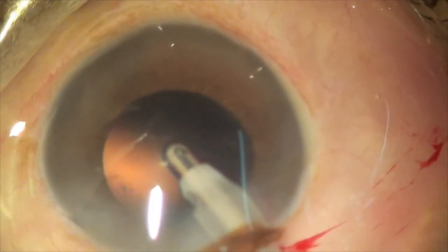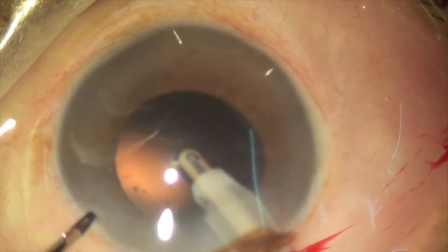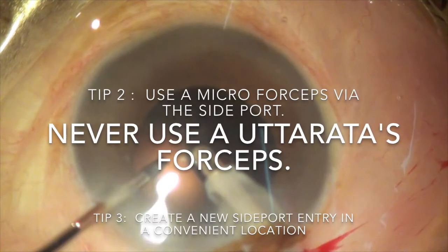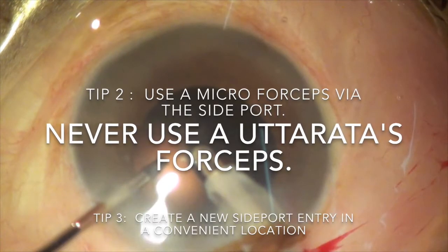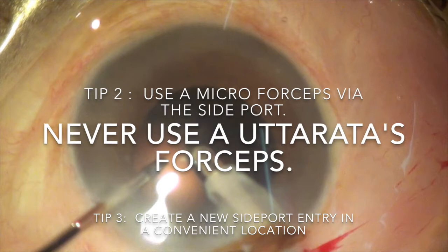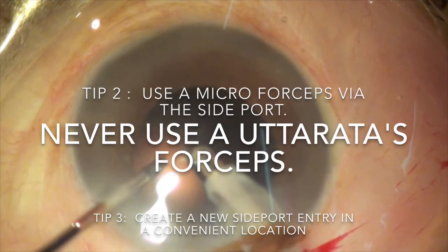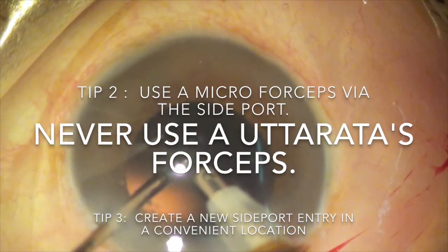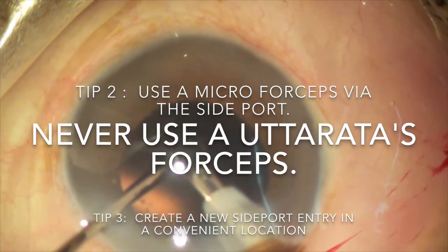To visualize better, I am putting methylcellulose on the corneal surface. Then I am taking micro forceps with my left hand, going through the side port and entering the anterior chamber. Tip 2 is: never use an utrata forceps.